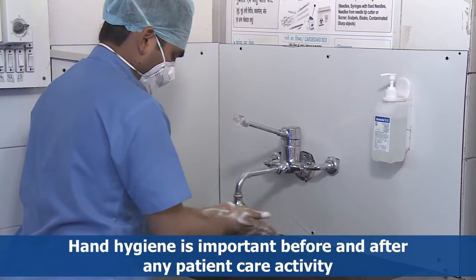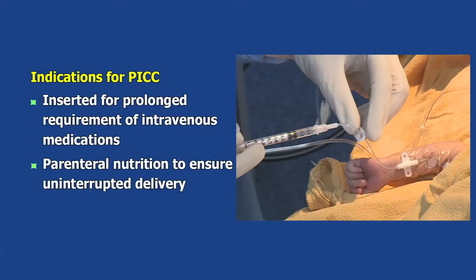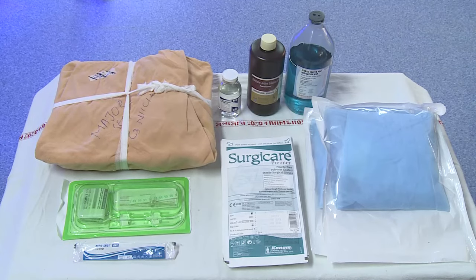In this video we shall demonstrate the procedure of PICC line insertion. A peripherally inserted central catheter, or PICC, is inserted for prolonged requirement of intravenous medications and parenteral nutrition to ensure uninterrupted delivery.